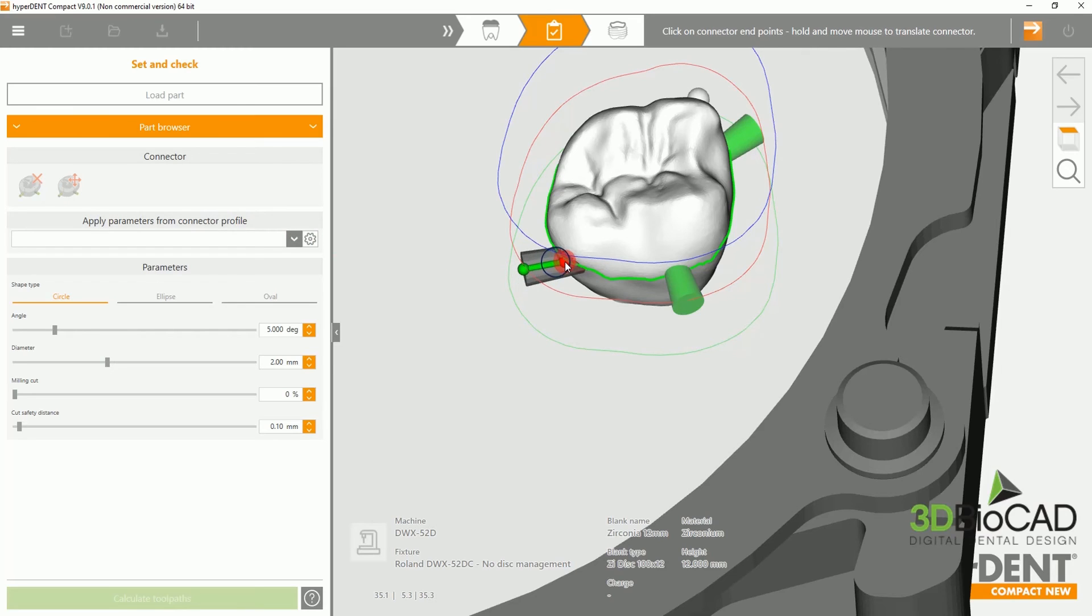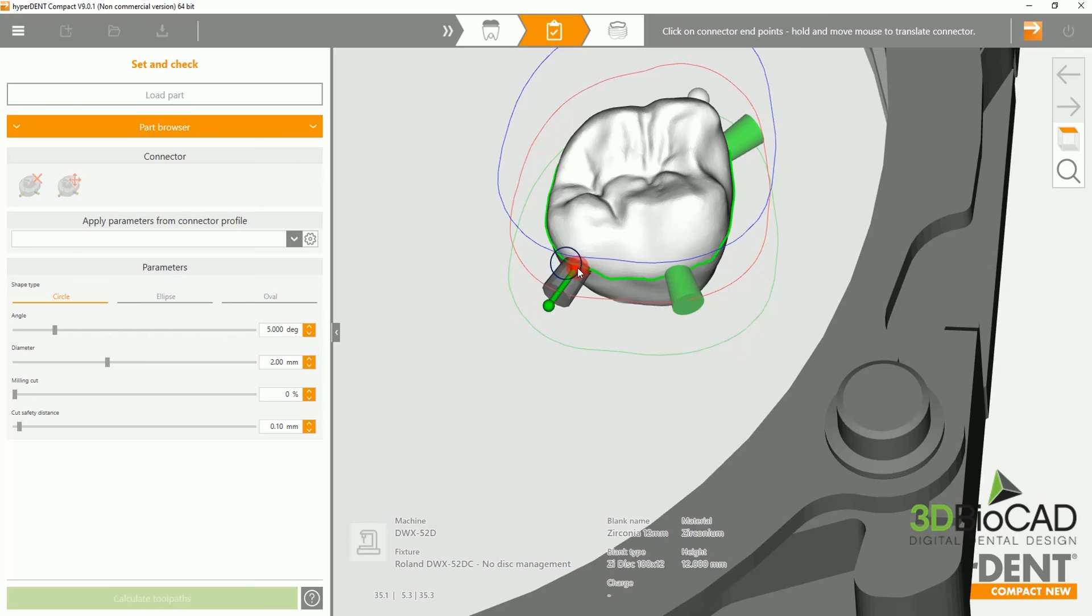Even though you've already placed a connector, you can manually move it or delete it.